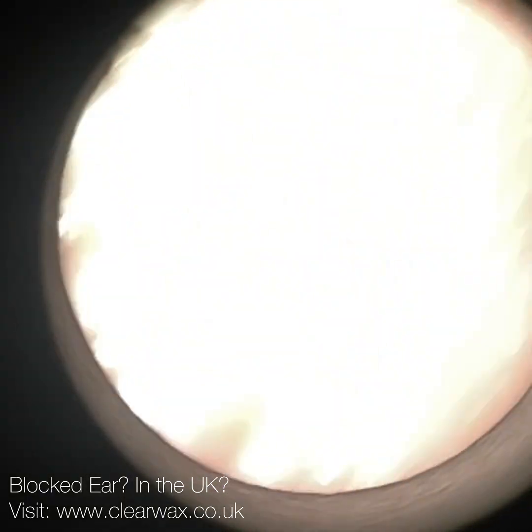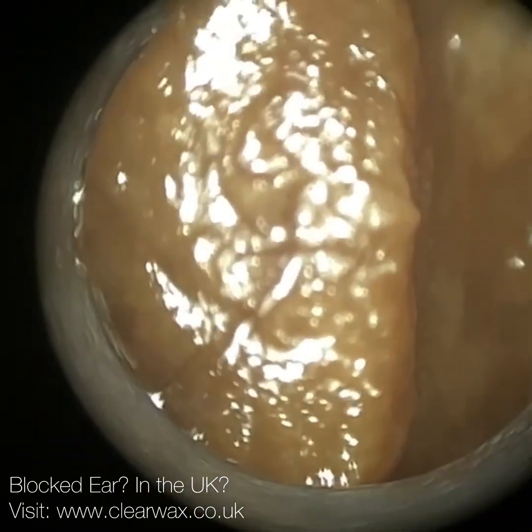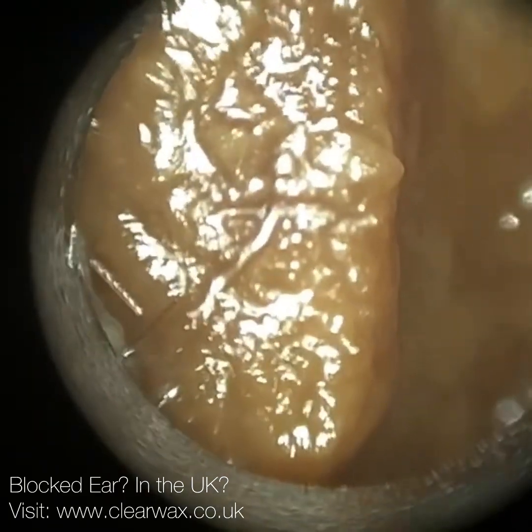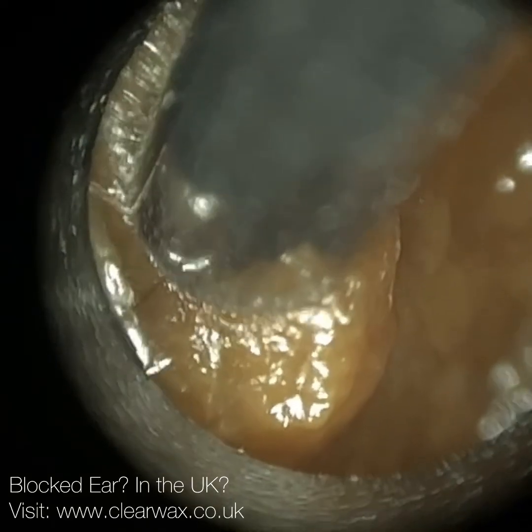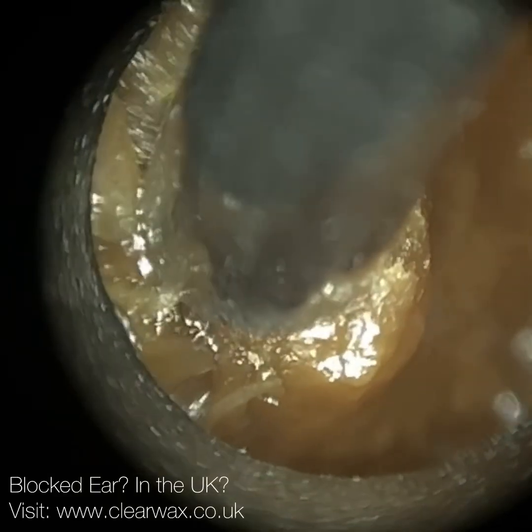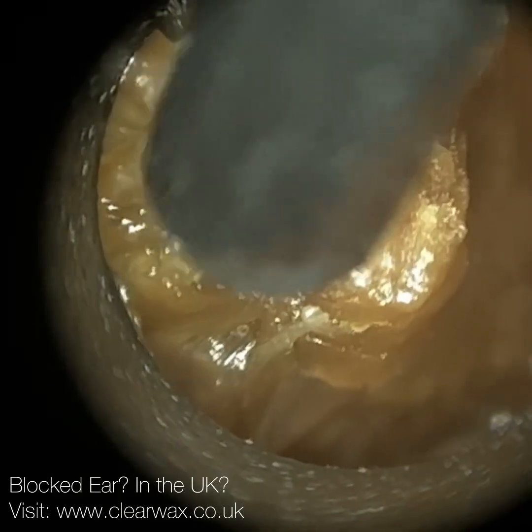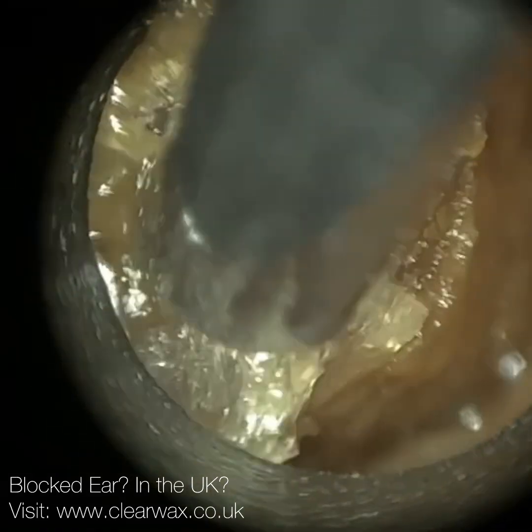Here we have a patient who attended with - I wouldn't say fully occluding earwax, because as you may have just seen, there is an opening at the roof of the ear canal. But I would classify this as a grade 3 earwax impaction, so approximately between 50 and 75% blocked. And interestingly, in this ear, they have a T-tube fitted, and you'll see that once I've removed the impaction.